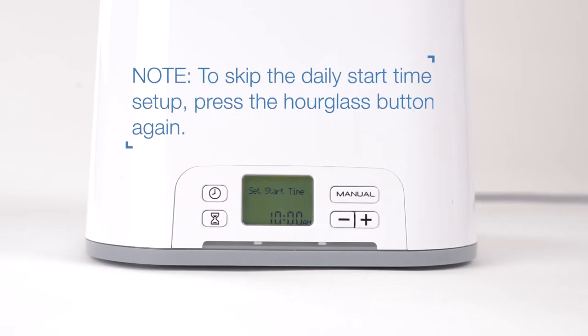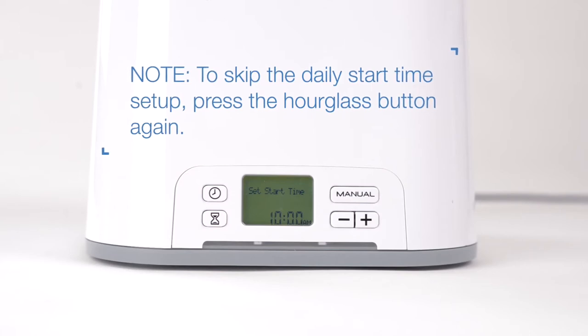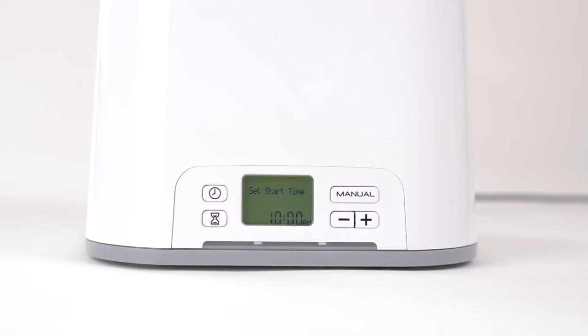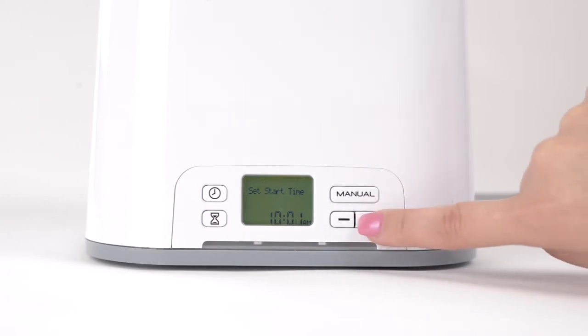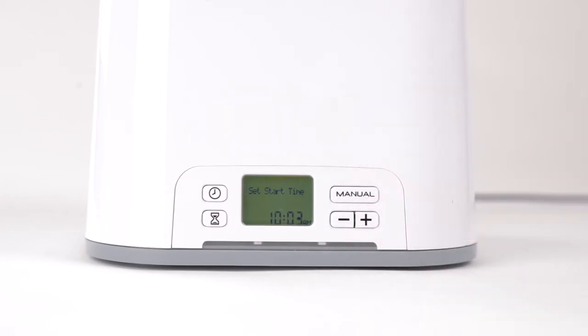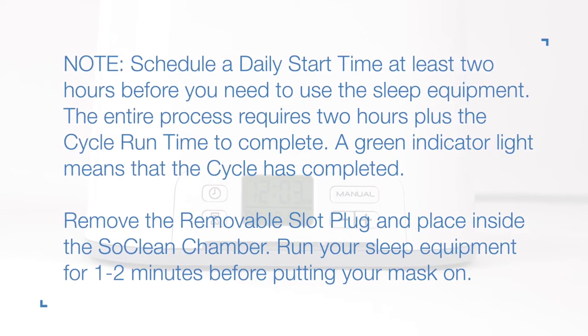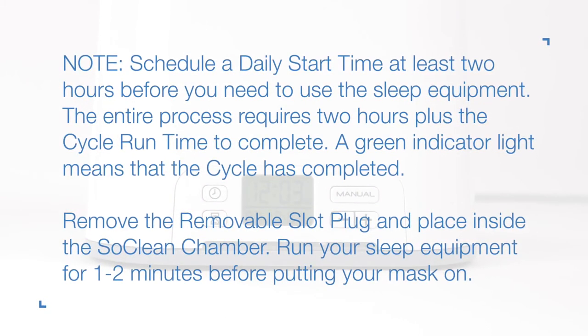To skip the daily start time setup, press the hourglass button again when you reach this step. Otherwise, press the plus or minus buttons to reach the desired daily start time, then press the hourglass button again to save your setting and return to the home screen. Note: schedule a daily start time at least 2 hours before you need to use the sleep equipment, as the entire process requires 2 hours plus the cycle run time to complete.